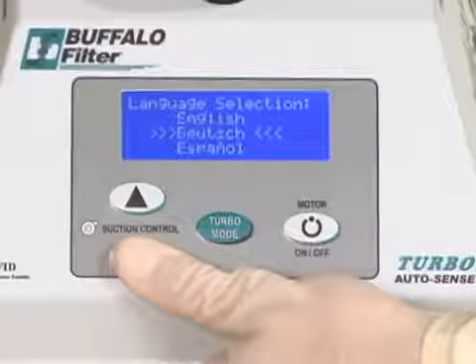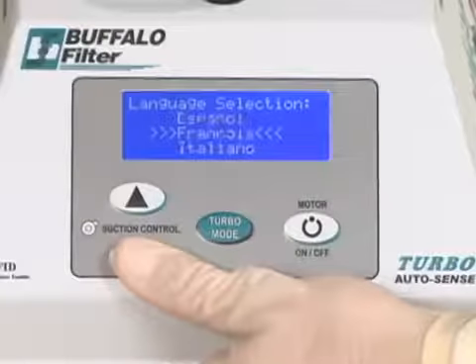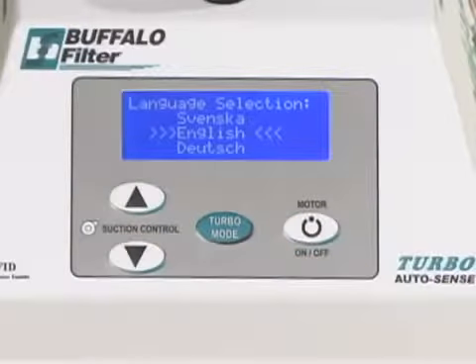The unit's LCD display may also indicate some service information, such as information about the motor brush life or filter identification issues. If this occurs, contact Buffalo Filter or your local representative for assistance.